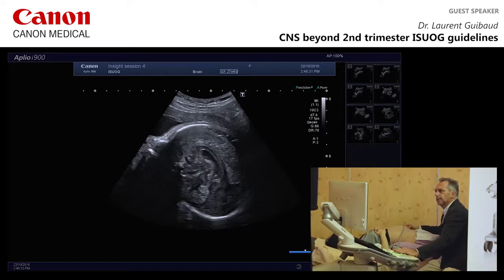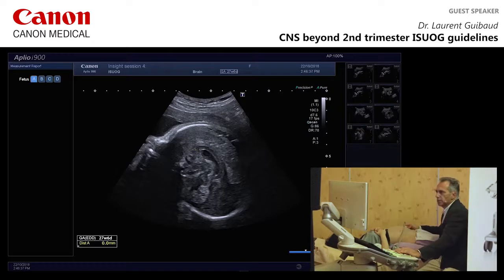You see this sulcus here. We discussed this sulcus. Which is the sulcus? The pericallosal sulcus, yes. And you may see here another sulcus, which is the marginal sulcus. You should have a look at this sulcus. If this sulcus looks thick or bright, what are you looking at? A lipoma. Yes, a pericallosal lipoma.